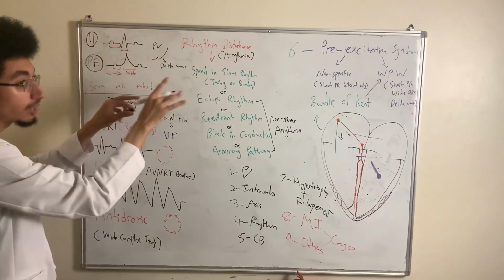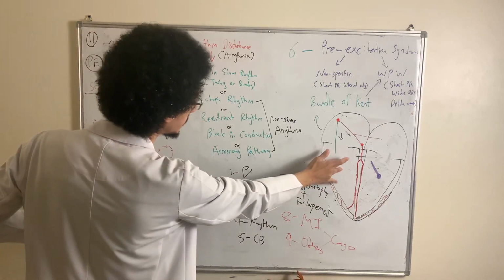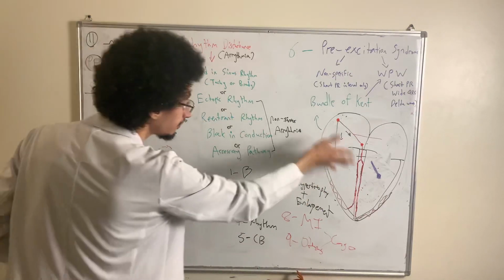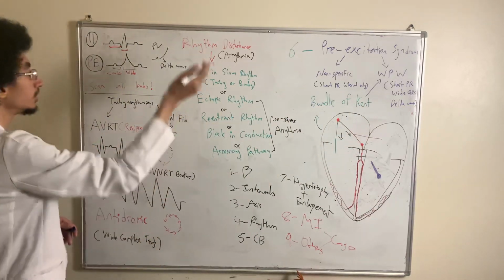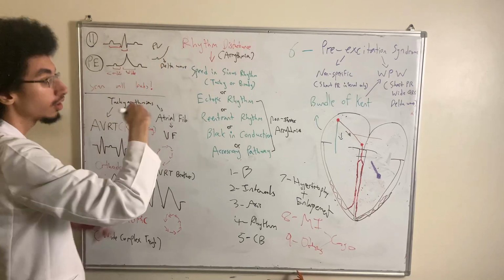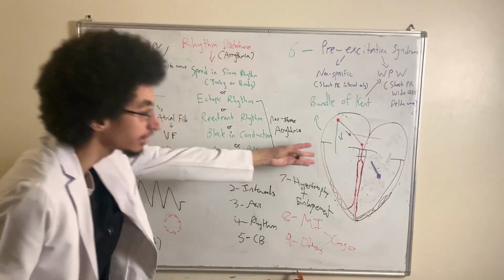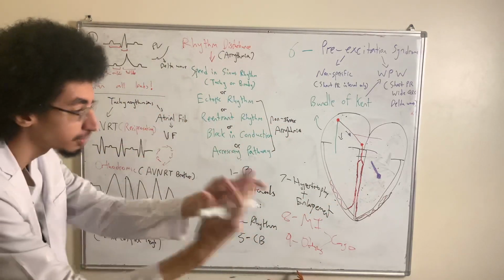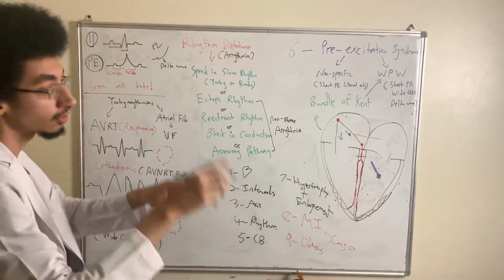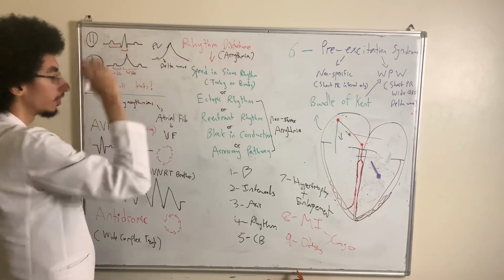And at the same time this is occurring, while there's premature activation of the right ventricle, you have the remaining left ventricular depolarization coming from the AV node. And this will continue, joining along with the R and the S wave. So when you have a depolarization of the right ventricle and a depolarization of the left ventricle, both of them coming together, especially with the right ventricle occurring very early, it will give you the picture of this.